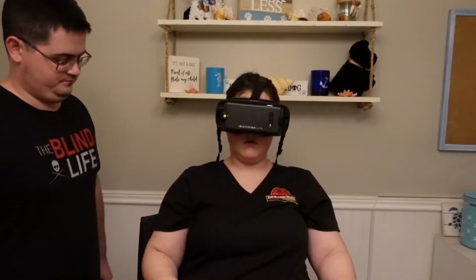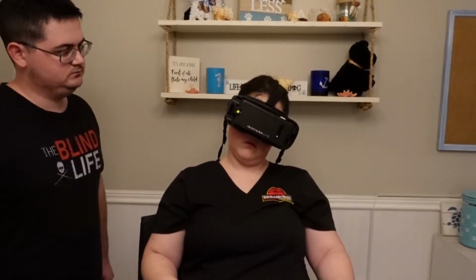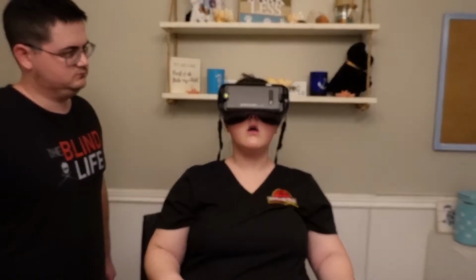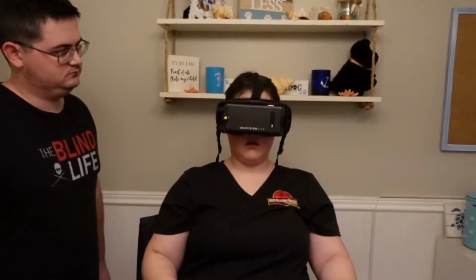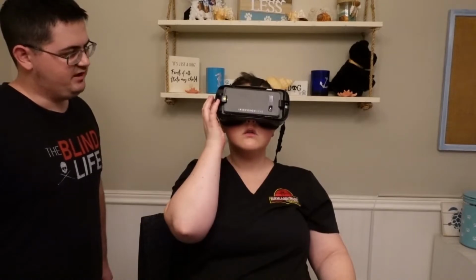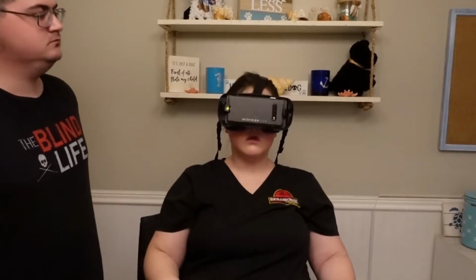So, step 1. Turn your head to place the viewfinder in the center of the screen to an area you wish to have magnified. This view will be enlarged in the upper portion of the screen. Adjust magnification with the viewfinder on your screen. Swipe horizontally towards your ear to increase the magnification. Swipe away from your ear to decrease the magnification. You can reposition the viewfinder using voice commands or the configuration menu.